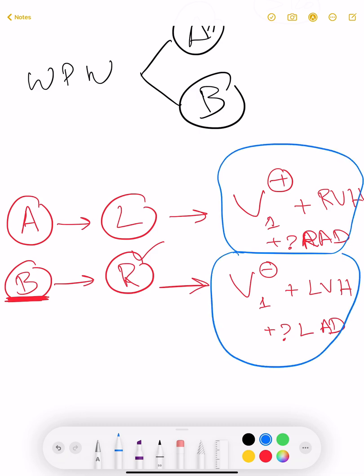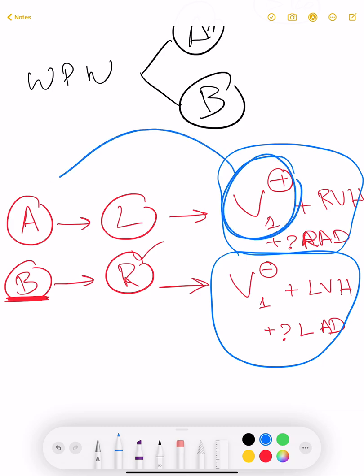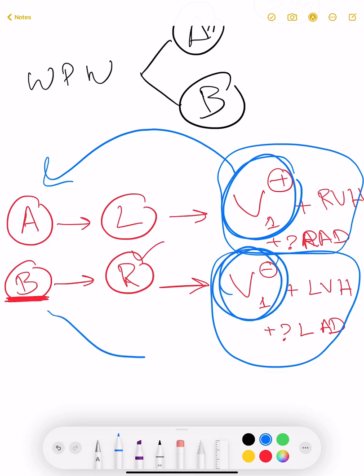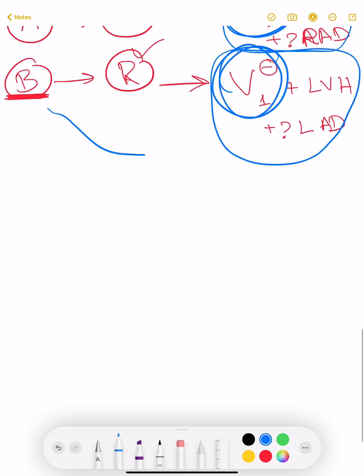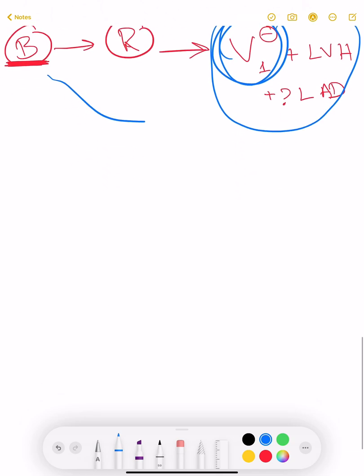There might also be left axis deviation in some cases of Type B. So in summary: look at V1 — if you have short PR, prolonged QRS, delta wave with positive V1, it is Type A. If short PR, prolonged QRS, delta wave with negative V1, it is Type B. Simple as that.